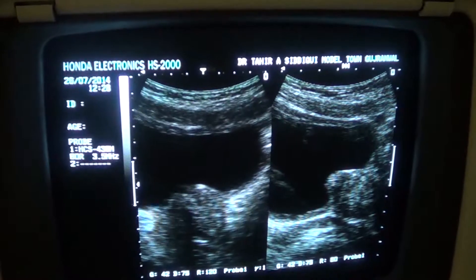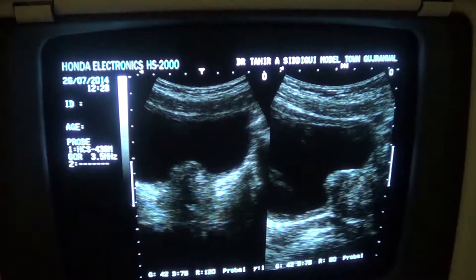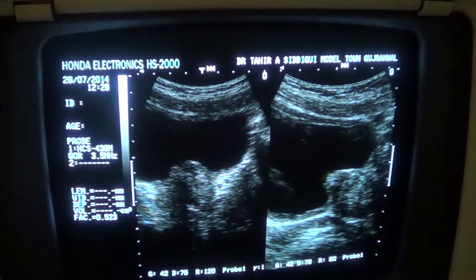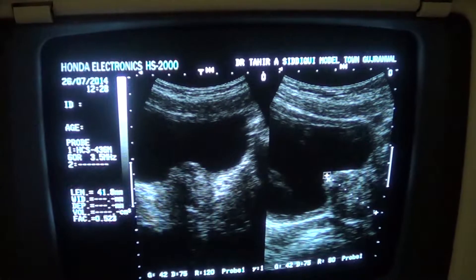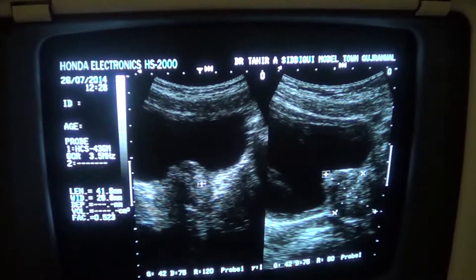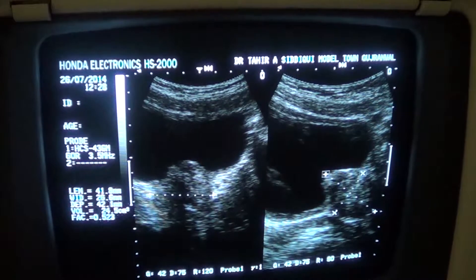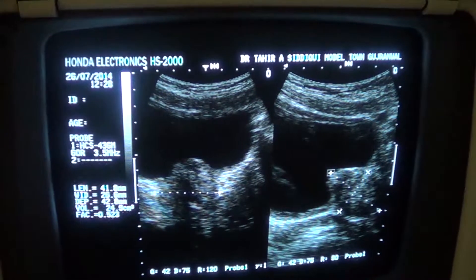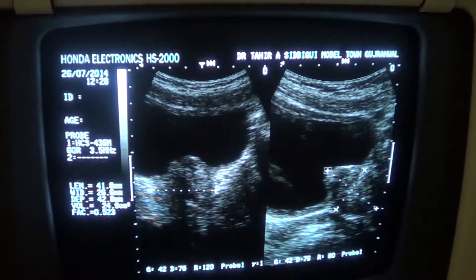The prostate measures approximately 4.1 by 2.8 by 4.2 cm. So the total volume is up to 24 grams, which is within normal limits.